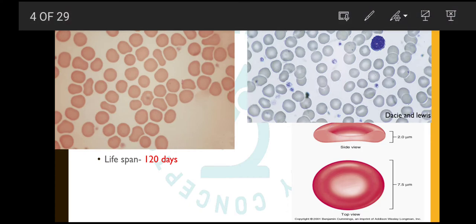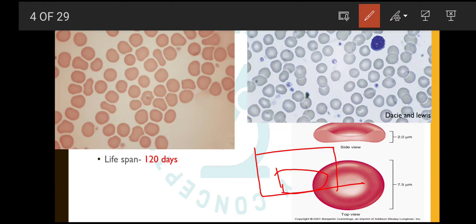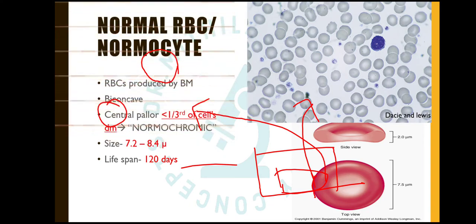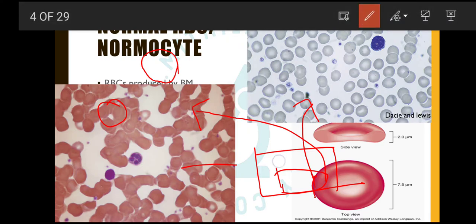When we examine a general blood picture, we should observe the correct area. The peripheral blood film is tongue-shaped. The area we examine is adjacent to the tail area, where the RBCs are just touching each other. In the tail area itself, the RBCs are far apart and their morphology is not appropriate for assessment. In the head area there is a lot of overlapping of RBCs. So we should not examine RBCs in the region of the head or tail — the ideal area to examine is the region adjacent to the tail.